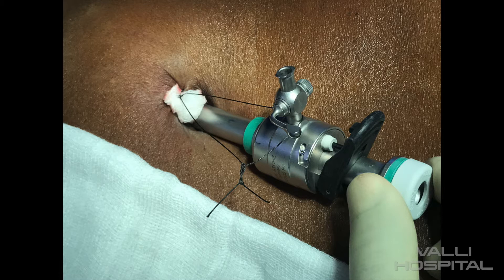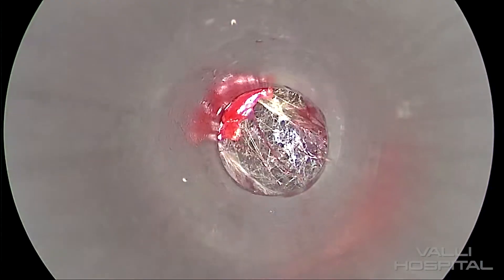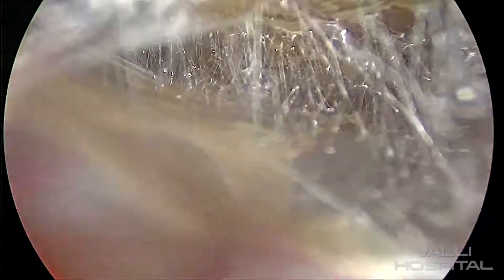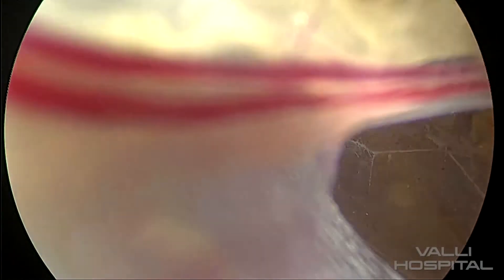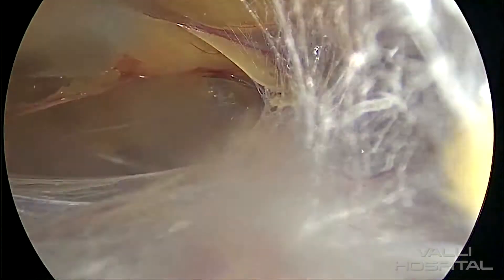Now the next step is the telescopic dissection. We use the zero-degree scope for dissection. The moment you enter, you check whether you are on the right track. Two points you must remember: one is the areolar tissue, and number two, you must go below the inferior epigastric artery — that is very, very important. Whenever you see a vessel, you come out and then change direction. You can go up to the symphysis pubis. You follow the cobweb — that is the areolar tissue, which is between the anterior and posterior lamina of the transverse fascia. When you see a vessel, go to the left side; you avoid the vessel, or you come out, look, and then go. Your movement must be forward and backward, not sideways.